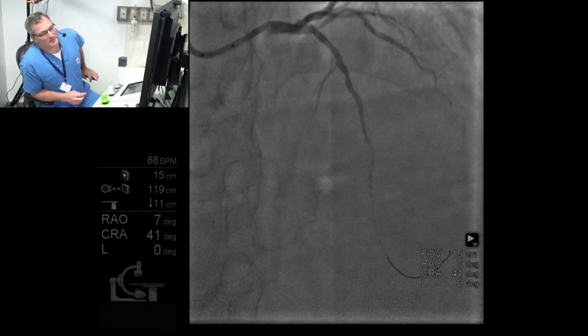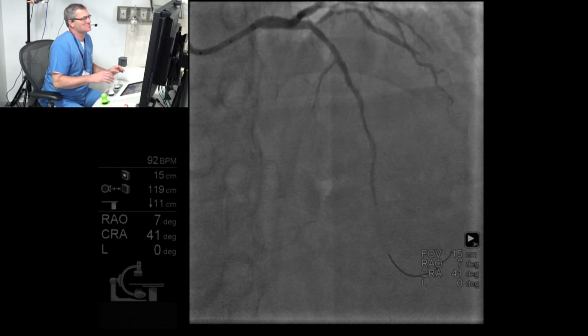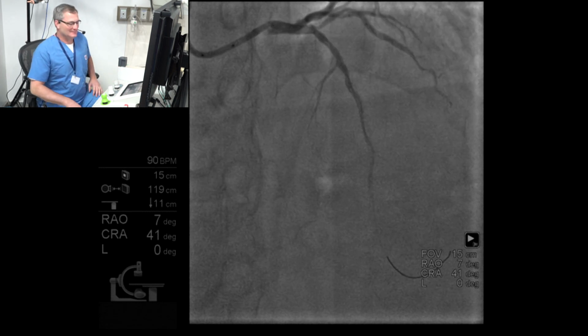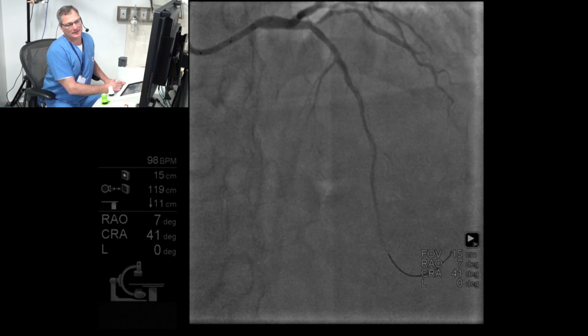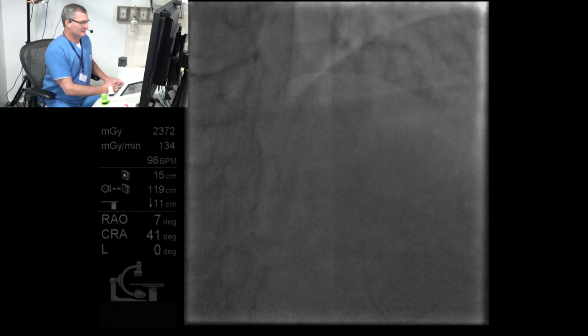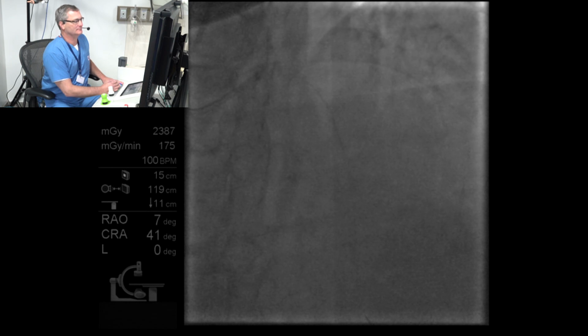Well, since this is the first Indian artery I've ever stented in India, I will take your advice, because to disagree and then have a perforation would get me thrown off faculty. My presumption is even 2.25 will give negative residual. Believe me, it'll go up to 2.75 if we need it to. I was thinking 2.75 up to 3.0.